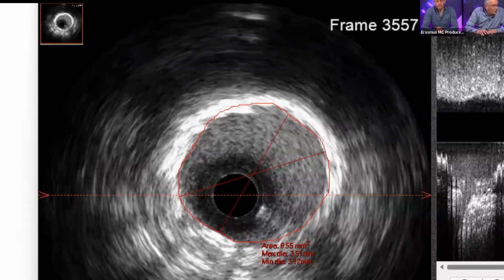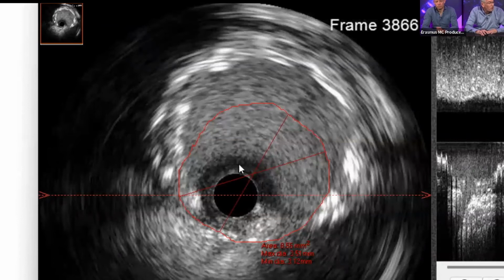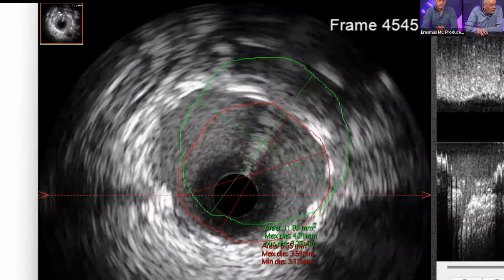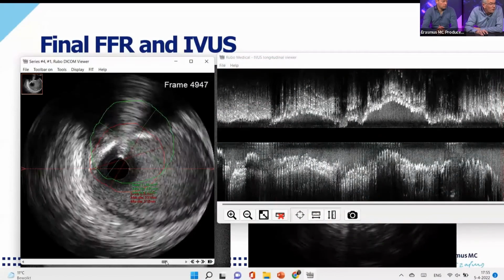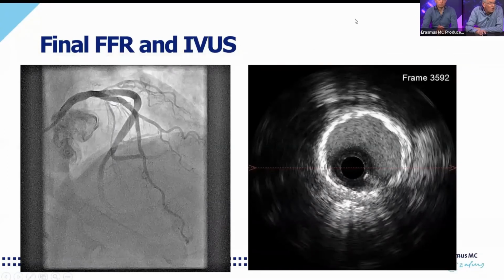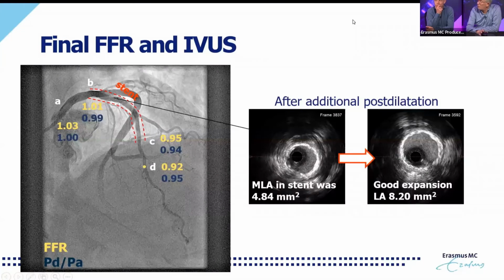Absolutely. And then if we compare now to the proximal reference here, remember that was approximately 9 when we measured. Well, here it's 11. So your balloon did also there the work, and the maximum diameter there was 4 millimeters. So I think we achieved something here, and of course here we see that it's overlapping the bifurcation with the circumflex. Now let's see, because now you will see if we have a result with the FFR.